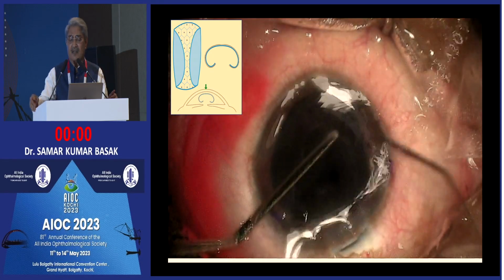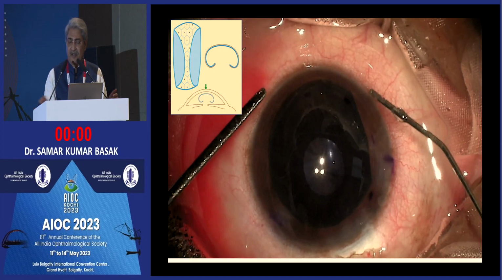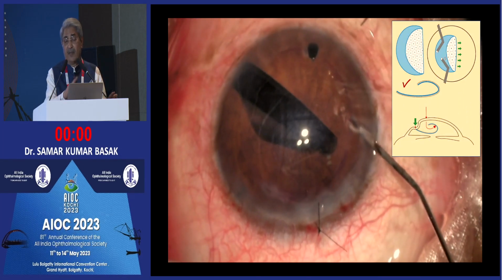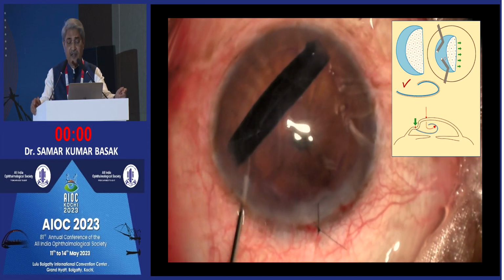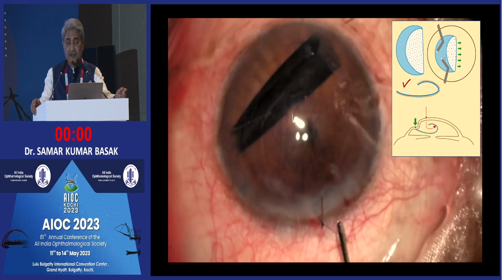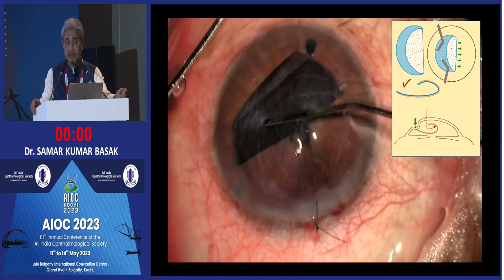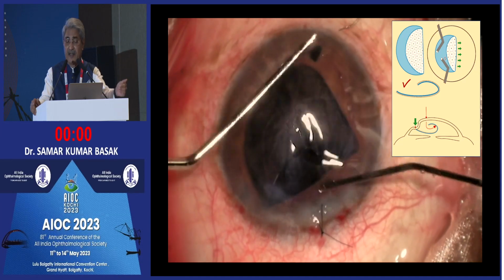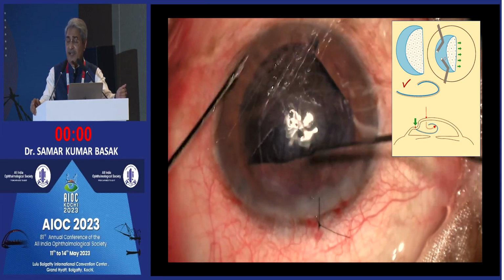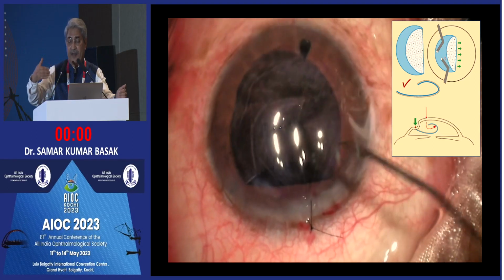Even then you can release fluid from the main port, a few strokes, and again the graft is open. This happens many times, but sometimes it is taco type unfolding. You again roll it. If you are not sure, and when you are sure, then you form a taco. When you form the taco, you pin one of the distal ends, and gradually you tap and take it the other way. It needs space to open up.